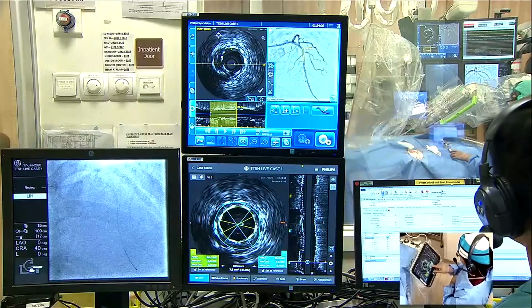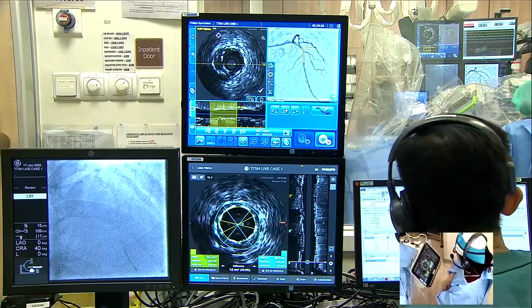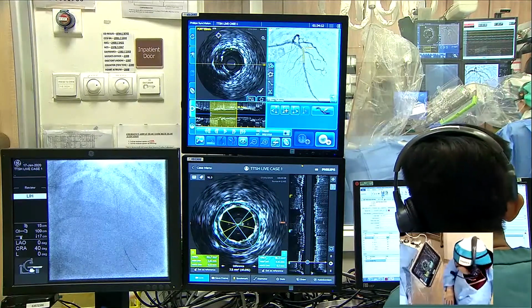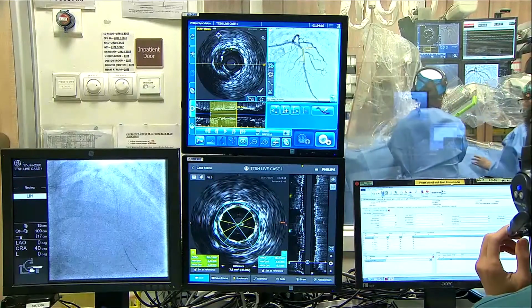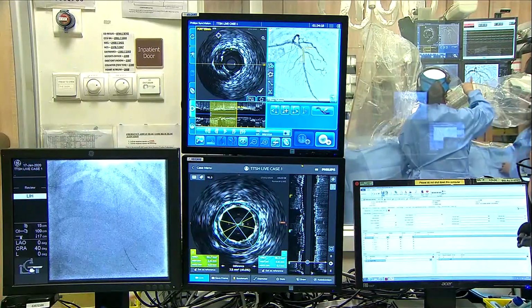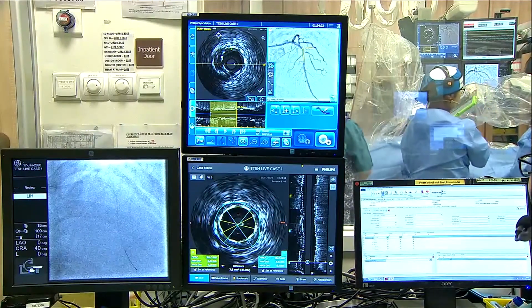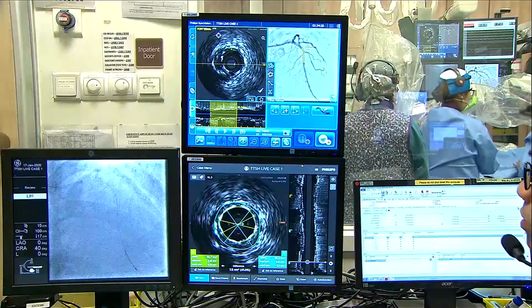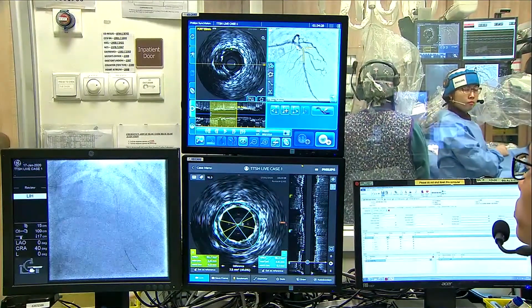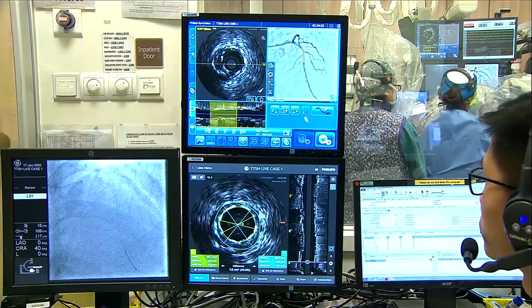Deborah, is the IVUS-guided out? Jiang, do you have any comments? Is there time for a final iFR? Okay, is the IVUS-guided out? If not, can we take it out? Can we see the measurement at the proximal end of the stent? The proximal stent edge. Because I thought, Deborah, that it was, Tony, underexpanded. Okay, can we just play it once for them?